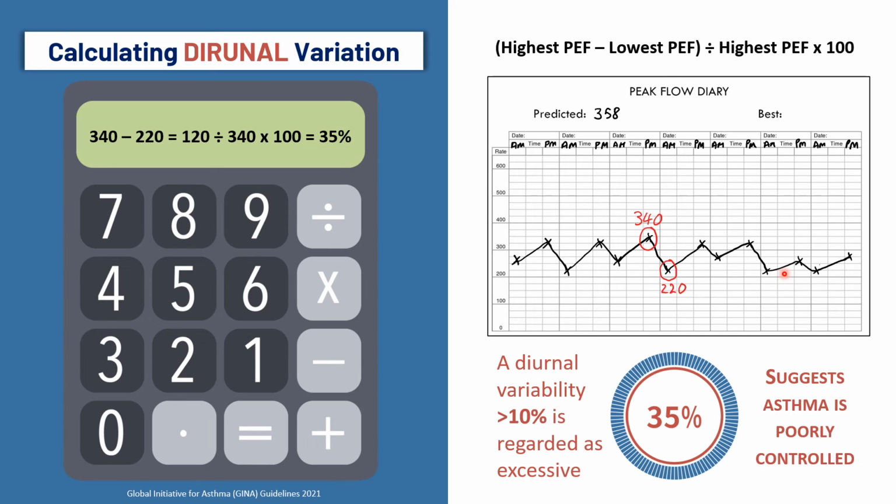And of course, what they discovered when they got the microchip out was that the patients had obviously not done it, and they just filled it in at the last minute. And it made me giggle because I don't think we need to do a piece of research to find that out. But from our perspective, you can only interpret what you're being given. You have to be certain that it's accurate data.